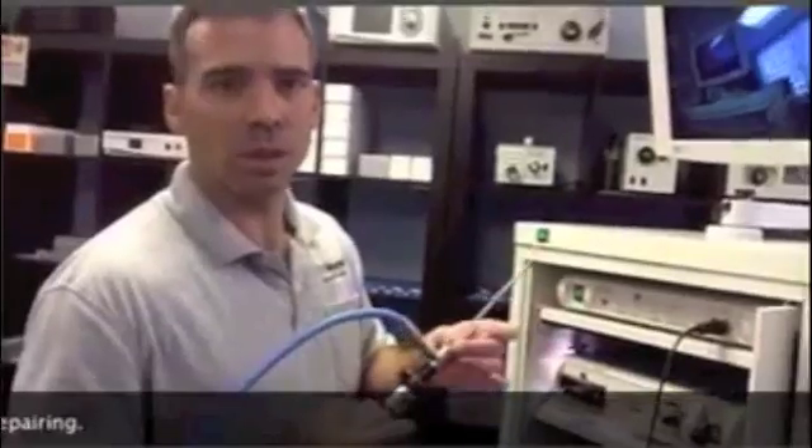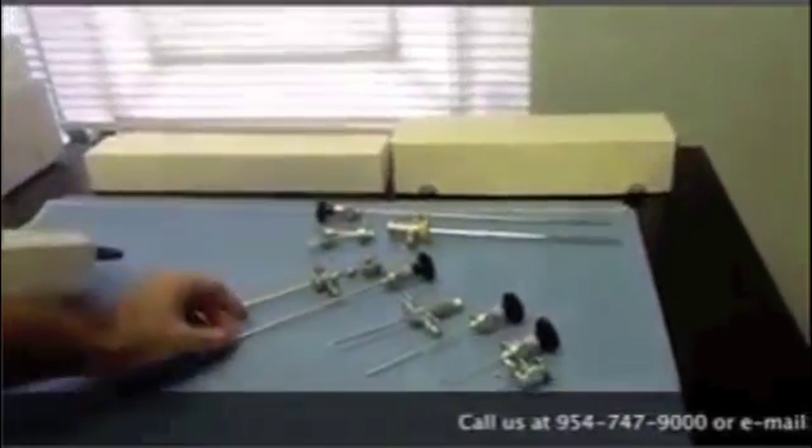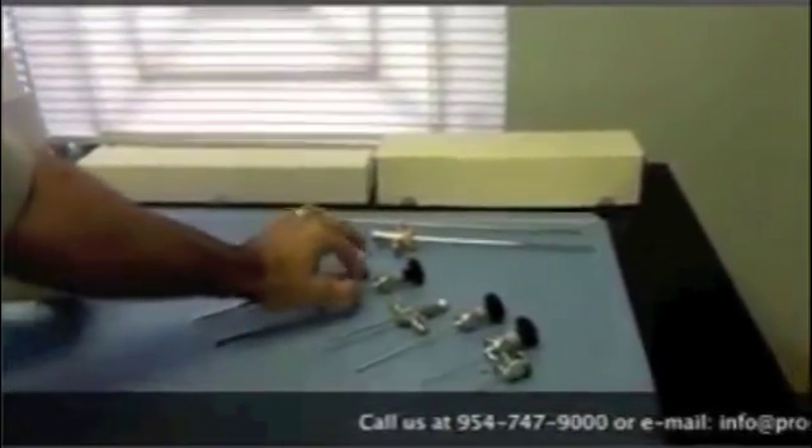Now I'm going to tell you what other scopes they use in arthroscopy. This is a different one but it's a four millimeter 30 degree. The working length is 175 millimeters.